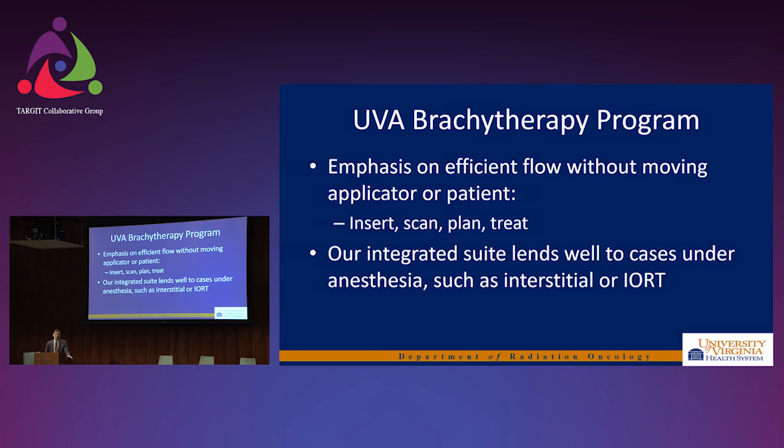We leverage our existing system to do all steps of the procedure. This is for all brachytherapy that we do, with a scan, plan, treat workflow. You place the applicator, do the CT scan, do the planning, treat the patient, and if the patient's under anesthesia, they wake up and everything's out already. Our suite lends itself very well to cases under anesthesia, such as interstitial cases, and intraoperative radiation therapy was an obvious thing.